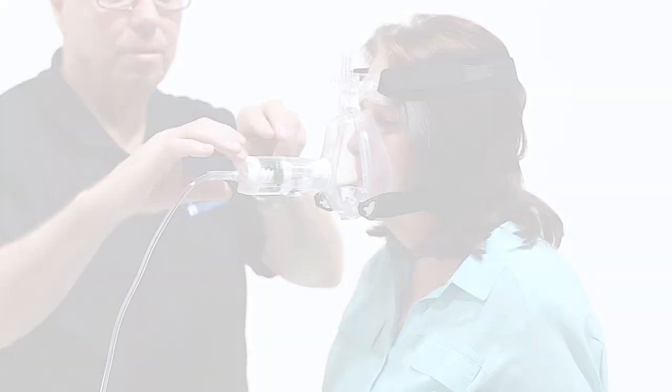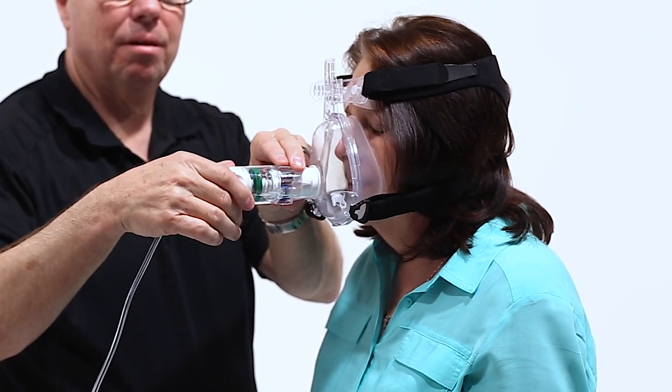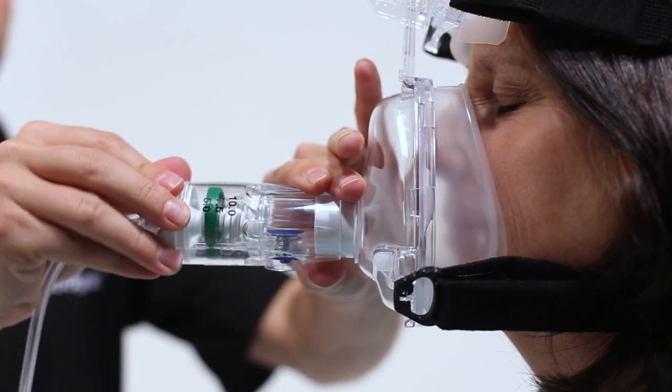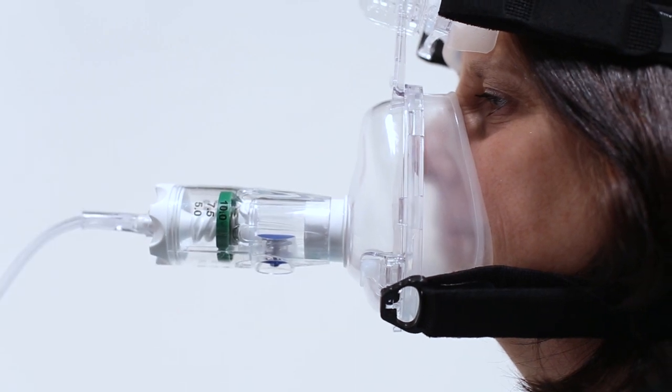Our GO-PAP comes with three PEEP settings. This PEEP as stated prior is independent of the flow in the tank. 5, 7.5, and 10 centimeters of PEEP will run accurately with 10 liters per minute of flow.